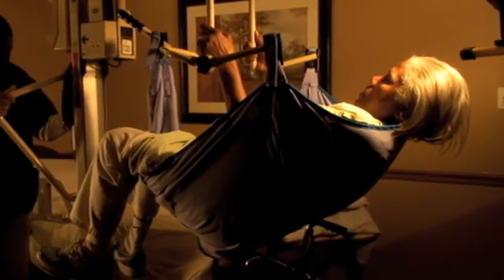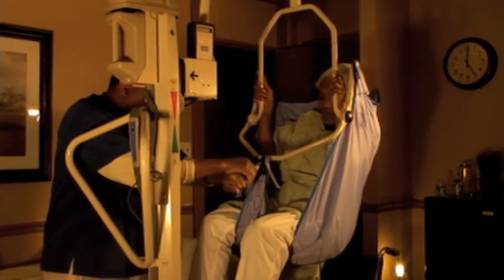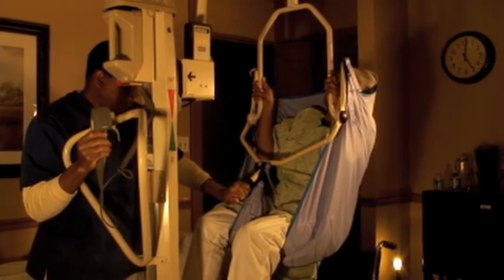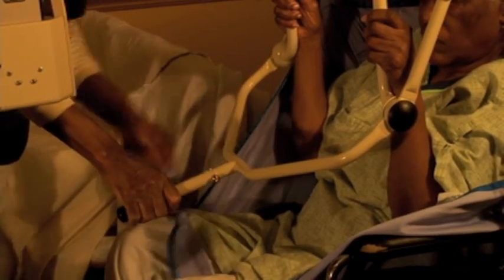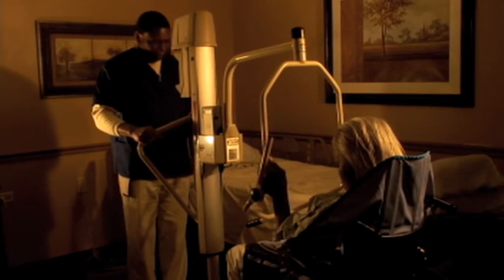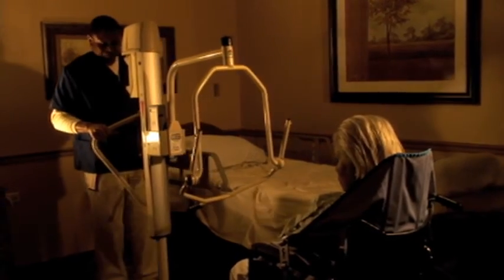To lower the lift, ensure the resident is over the new bed or chair and slowly press the button on the control box. As the resident is lowered, adjustments should be made to ensure they are placed properly and comfortably. Once sitting up in a chair, the sling can remain underneath the resident until they are moved back to the bed.